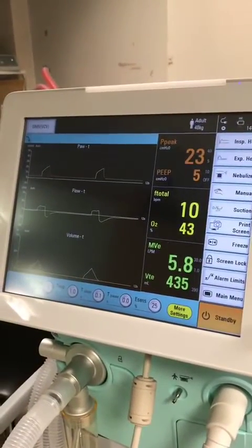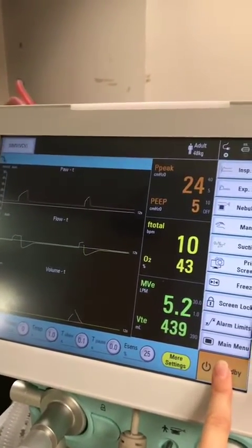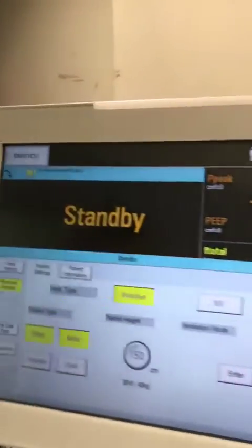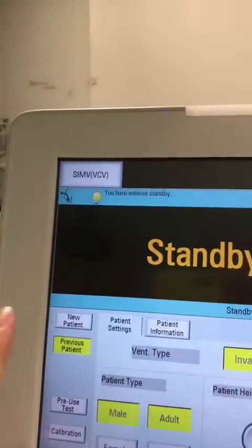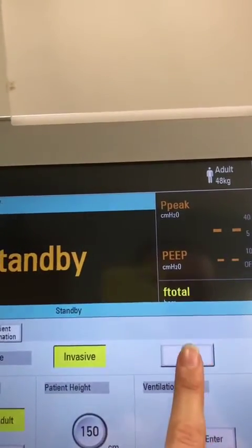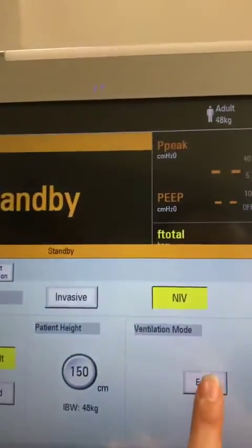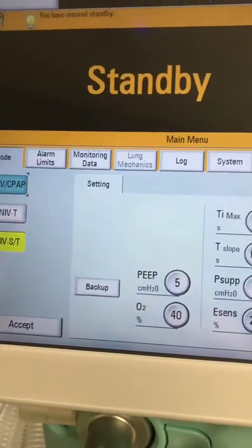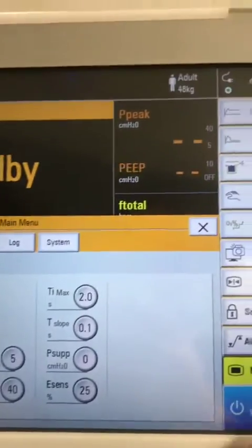To switch from non-invasive to invasive, or invasive to non-invasive, you first need to stop ventilating by pressing and holding your standby button for three seconds. Then you need to select a new patient, because the buttons won't activate otherwise. Go across to new patient — we're already on invasive, now we're switching to non-invasive. Then press enter, pick which mode you're going to use, click accept, and press start ventilation.